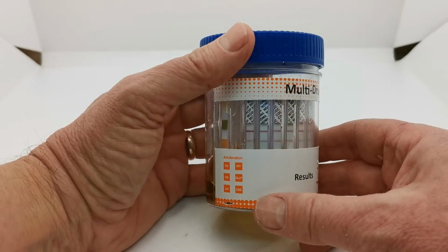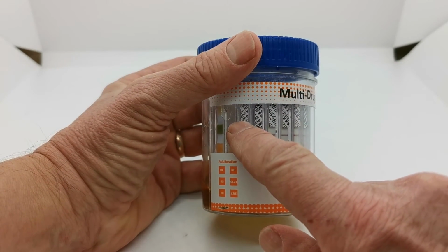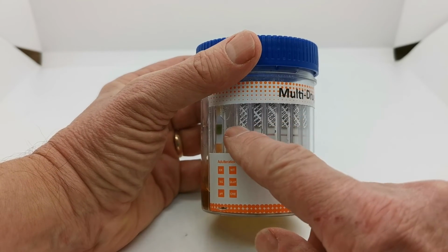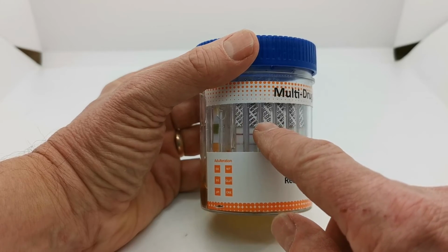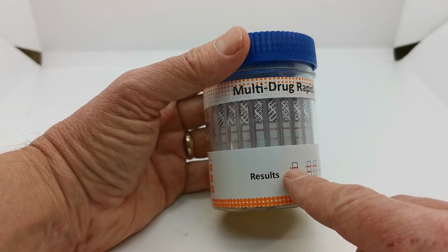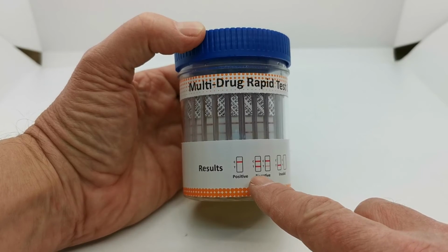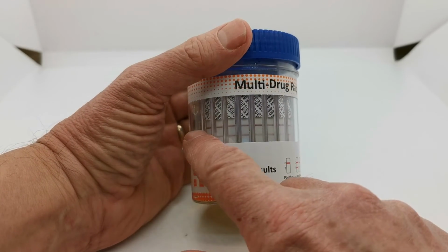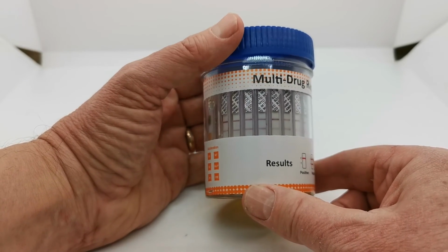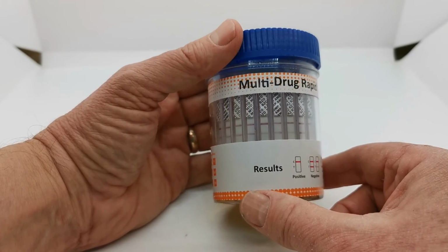At the read time, you are now coming to look at the drug test results. The abbreviations for each drug group are shown here at the top of the test strips embedded into the side. So MOP, MDMA, COC, etc. You are looking for control lines as indicated by the top line here, indicated on the results examples as a C. Every single one of your drug tests should have a control or C line showing. The drug test result for each drug group is indicated by the presence of a test line.